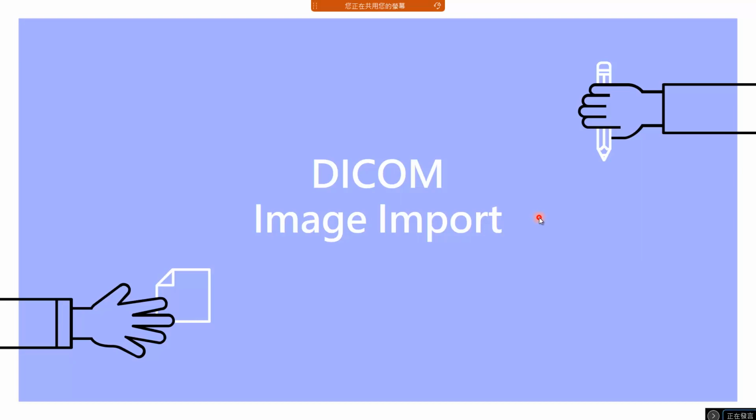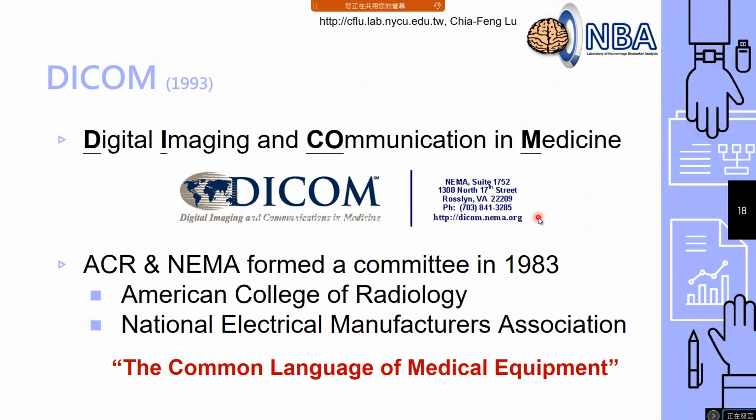So for the second part, I'm going to introduce Dicom. Okay, so what is Dicom? This is a full name. The full name of the Dicom is Digital Imaging and Communication in Medicine.